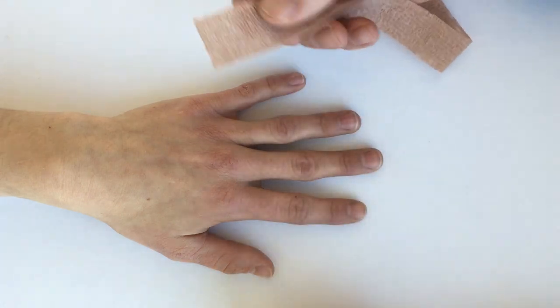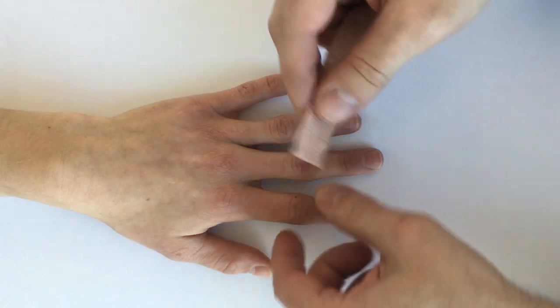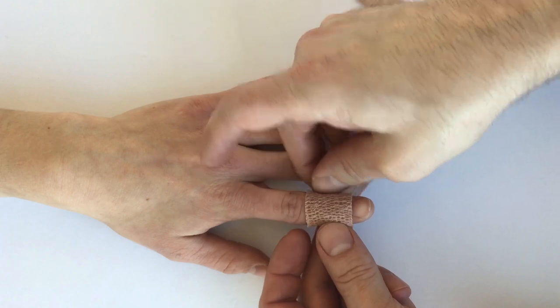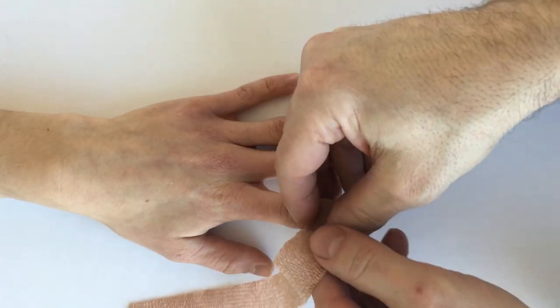When using Coban or some other self-adhesive elastic bandage, you're going to start at the distal end of the finger and leave the tip of the finger exposed so that you can monitor for color and circulation.